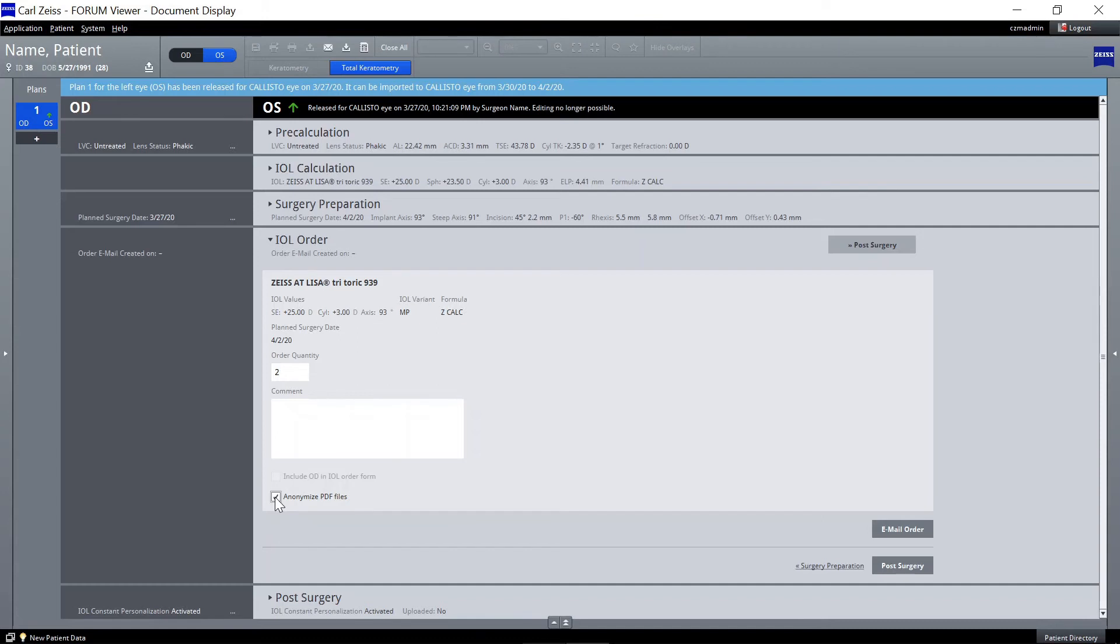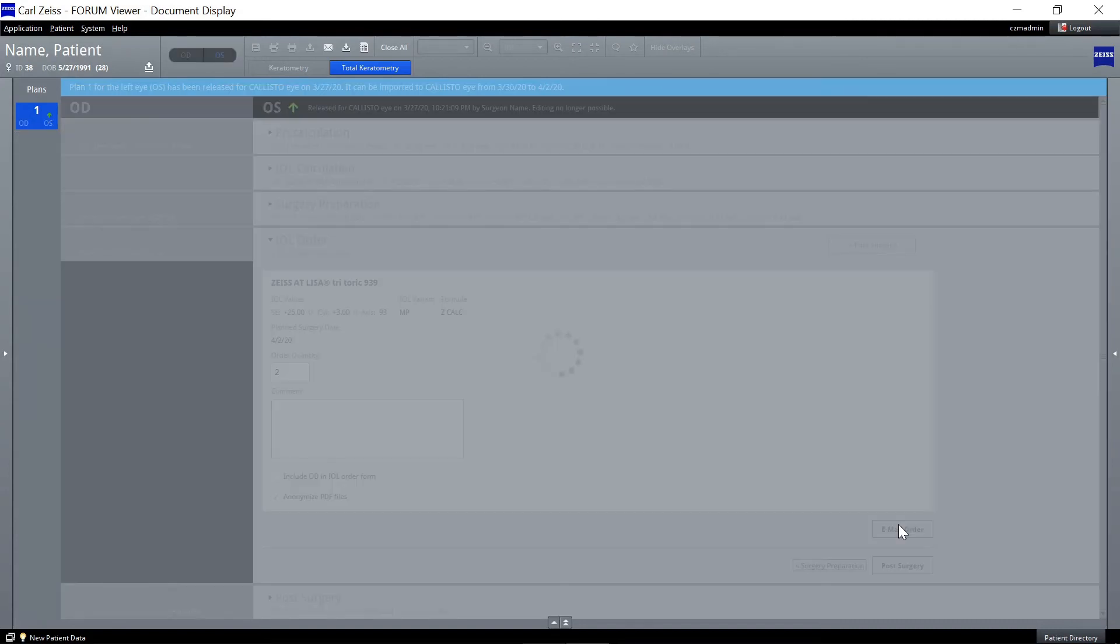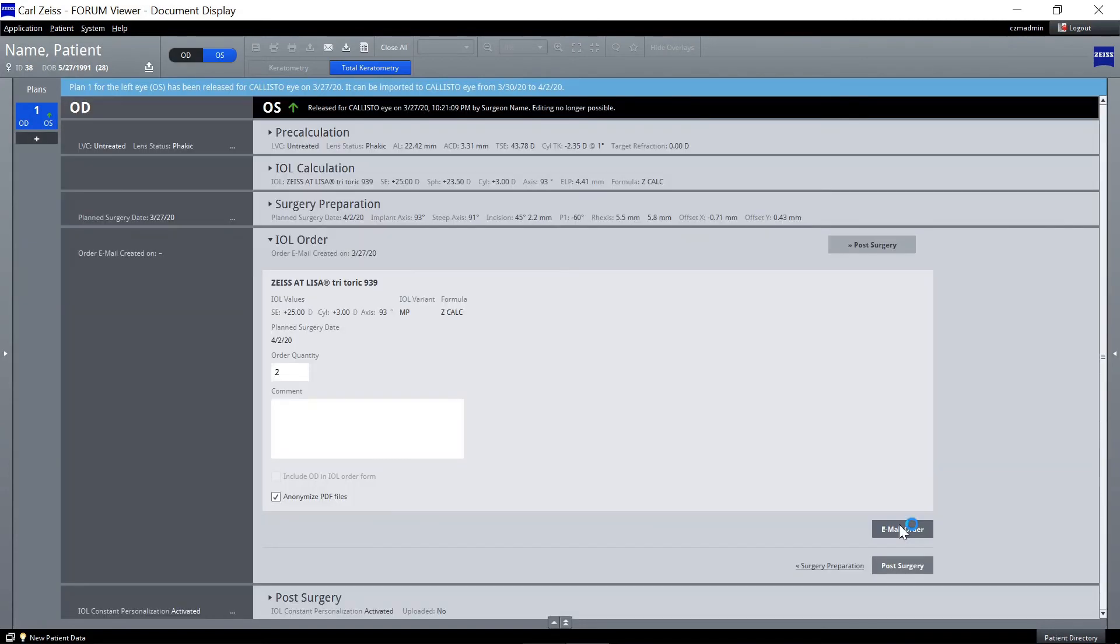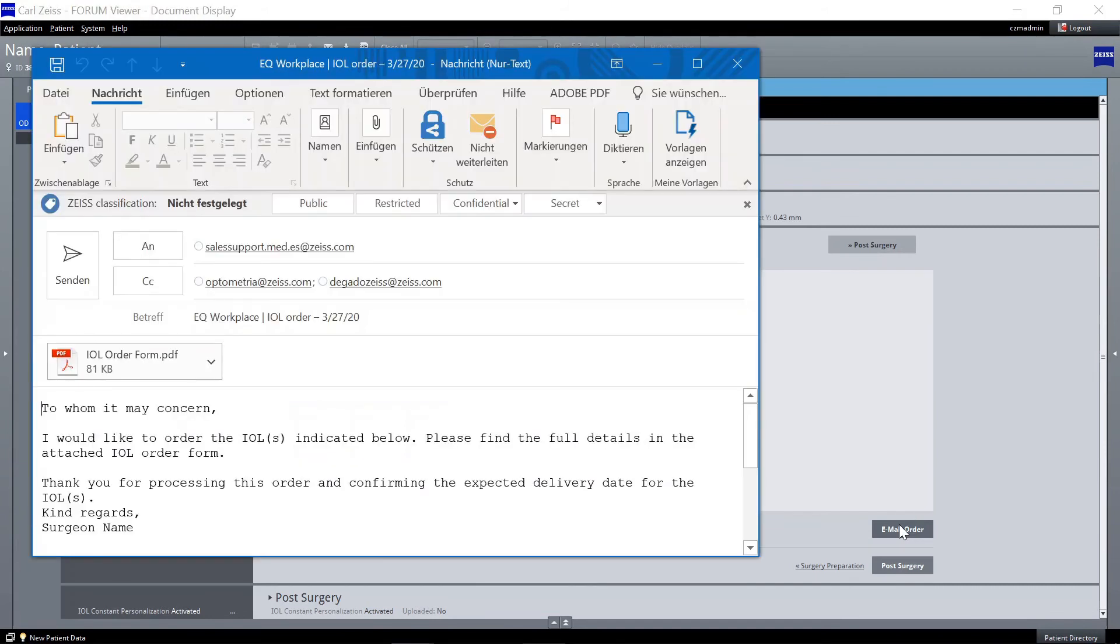Activate the checkbox Anonymize PDF files if the email and IOL order form shall not contain any patient-related data. Click on Email order to generate the order email in your standard mail program and send it from there to complete ordering.